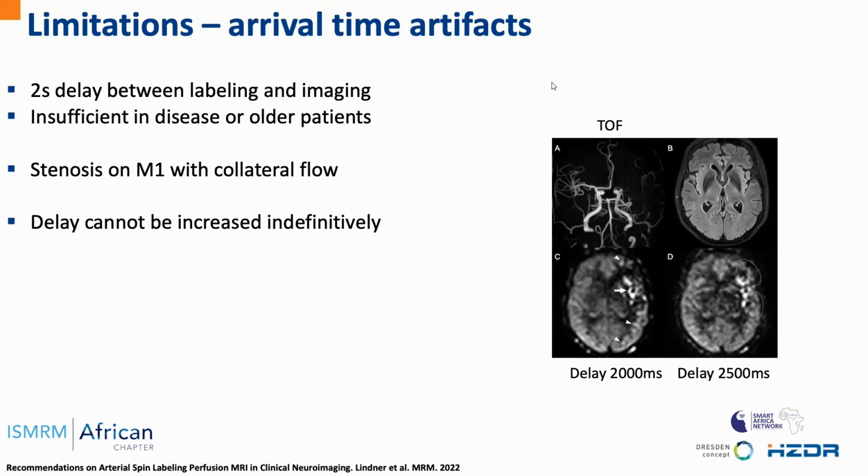The problem is that, of course, we cannot increase the delay indefinitely, as this would decrease the SNR of the imaging. So it's good to follow some recommendations about what the delays should be for specific diseases and populations, as indicated in this article.